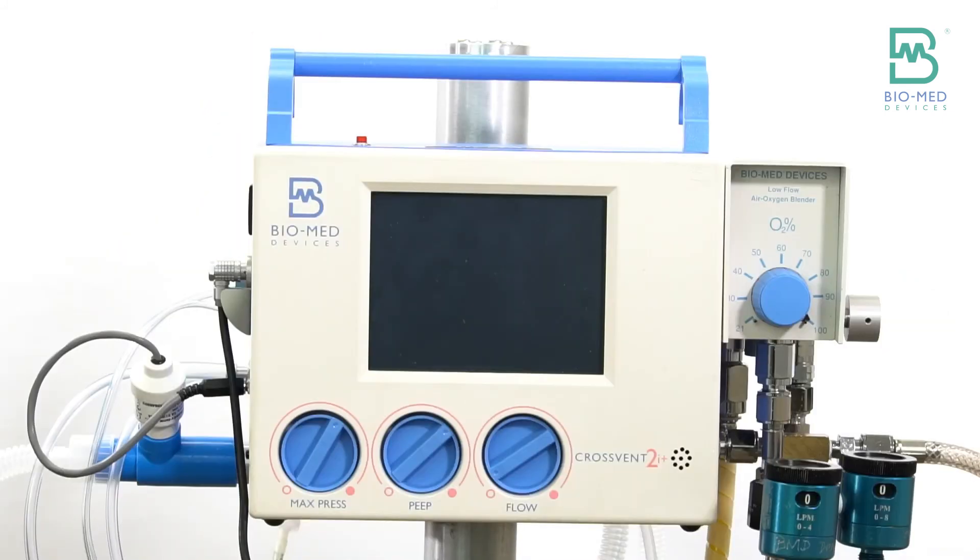The other thing too is the CrossVent is actually more gas efficient. The old MVP-10 is a pneumatically powered vent and uses gas to run itself. So it actually consumes a lot more gas.